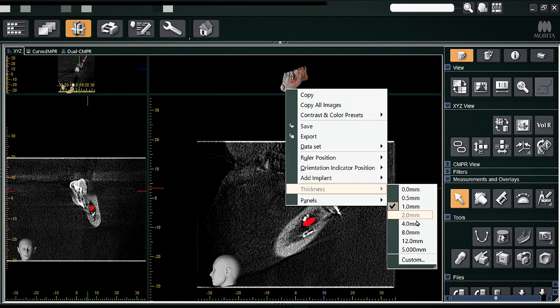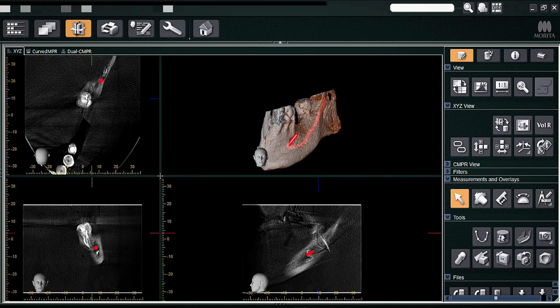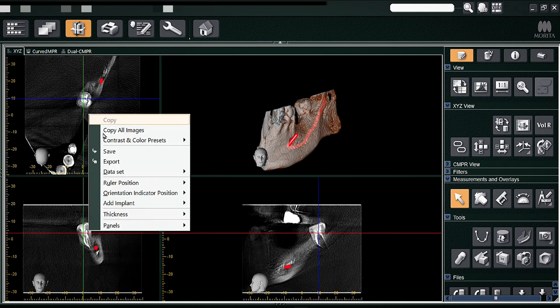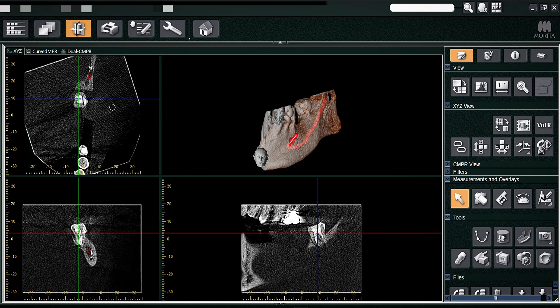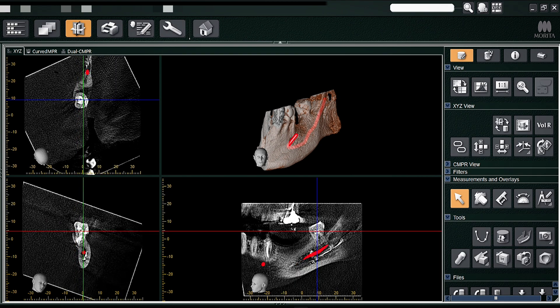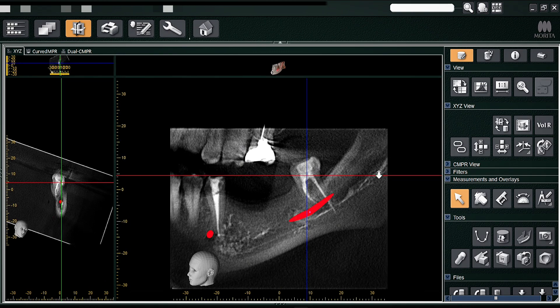I'll just increase the thickness from 1 mm to 4 mm so that the findings are very well appreciated. We'll align the tooth along the long axis, and in 4 mm or 8 mm thickness you can make out very clearly how the endodontic sealer has spread from the posterior region to the anterior region.